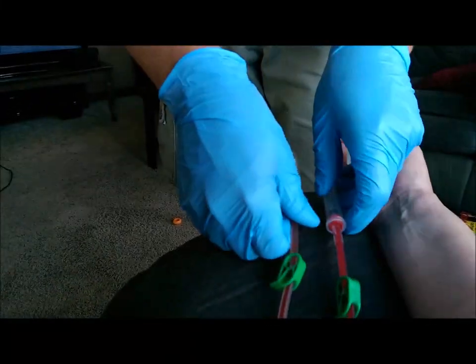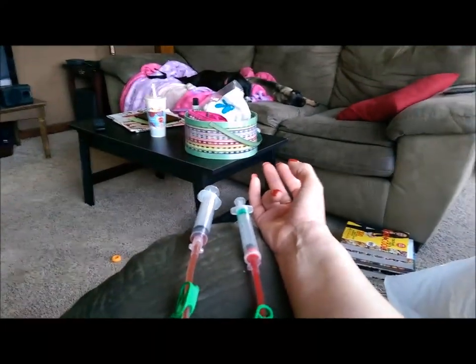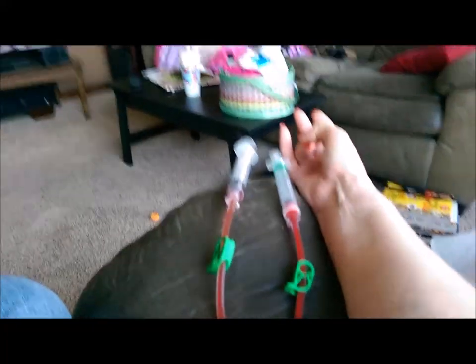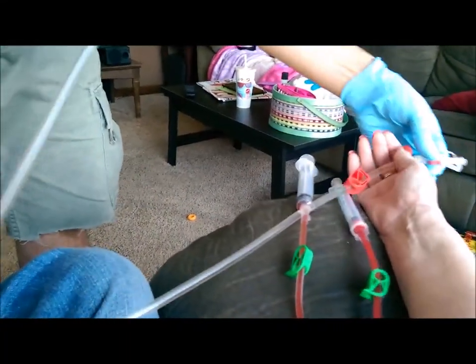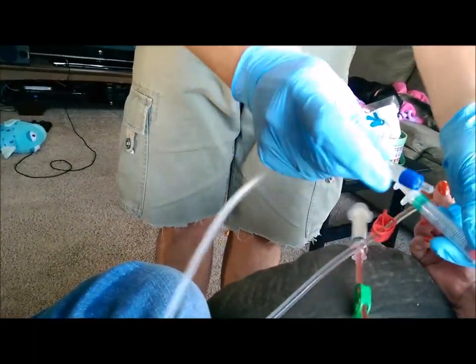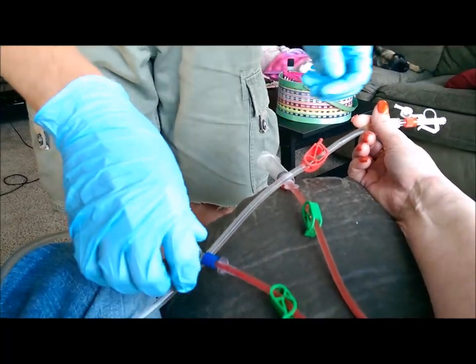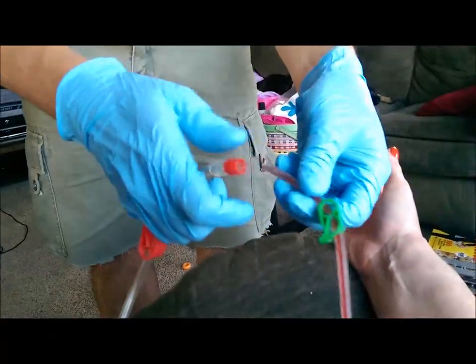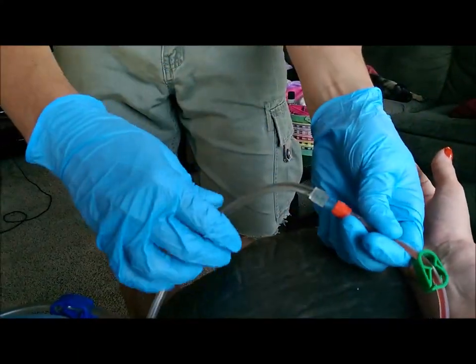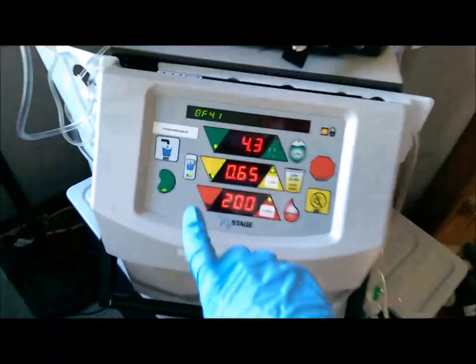Once a month we draw blood for the doctors at the dialysis center, and at the same time we draw blood for the transplant clinic in Milwaukee and the transplant clinic at Mayo. We use these tubes to draw the blood and we have a centrifuge — so we have a little blood lab in our kitchen now. Now we're going to connect the lines to her tubes, starting with the venous. We remember because blue is at the top and blue is the sky, so we connect the blue sky tube to the top one, and then the red one. I unclamp all four and press the kidney machine button.